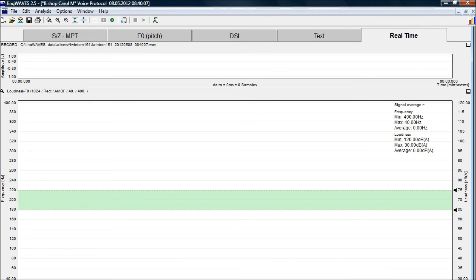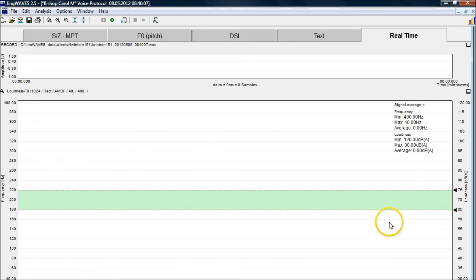This is the real-time screen from the LingWaves voice protocol and it measures pitch, SPL loudness and duration in real-time. It's useful for your own assessments and also in treatment tasks for client biofeedback and for measuring progress on treatment tasks. You can actually set your goals for loudness so the client can see whether they're within their goals.